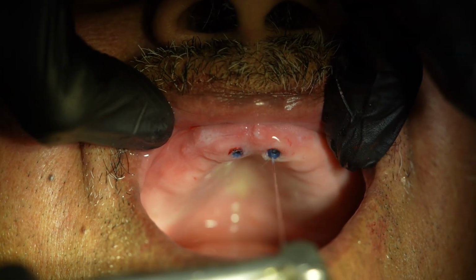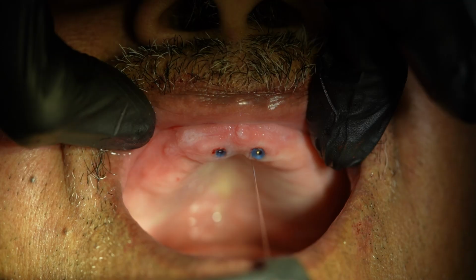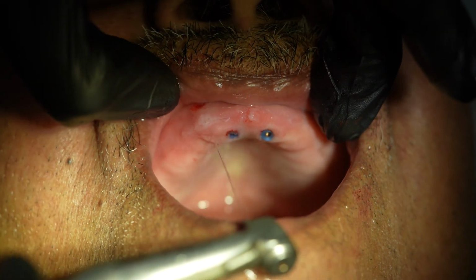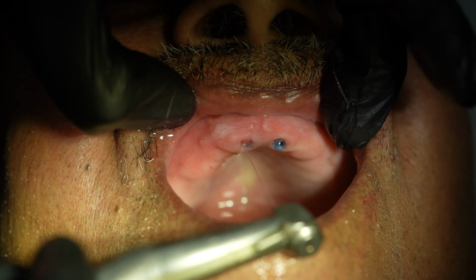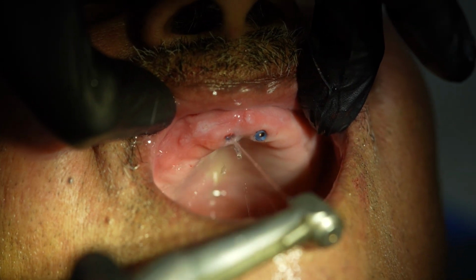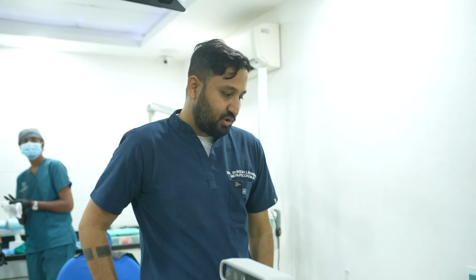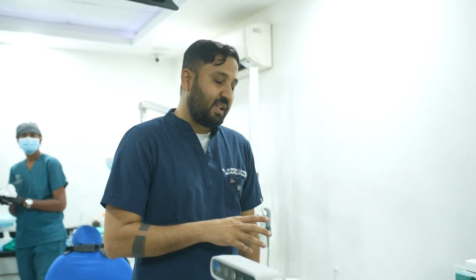So now you can see we have placed the two cover screws, and this is how the implants are placed, flapless, completely done, palatally placed, because that's how the bone morphology is, which I will show it to you on a CBCT. So now I will go through the planning part of it.